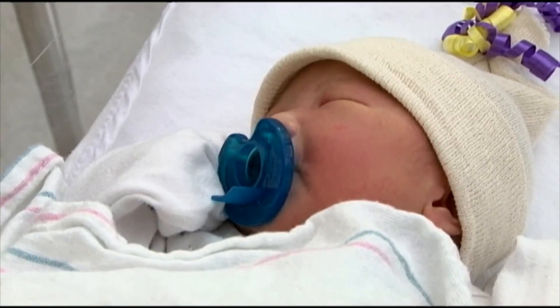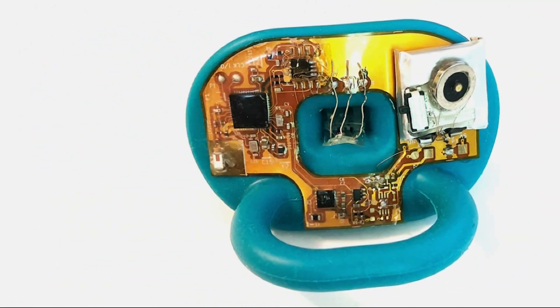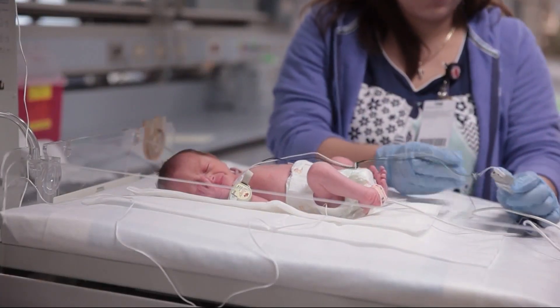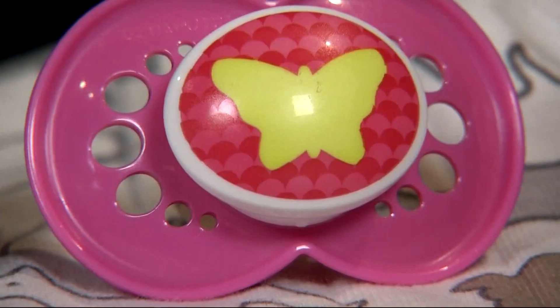Clinical trials are still to come, but they hope the small medical device eventually replaces blood draws and a lot of wires and electrodes on NICU babies. And then it could be developed for use at home so parents can do a variety of different health checks of their babies.